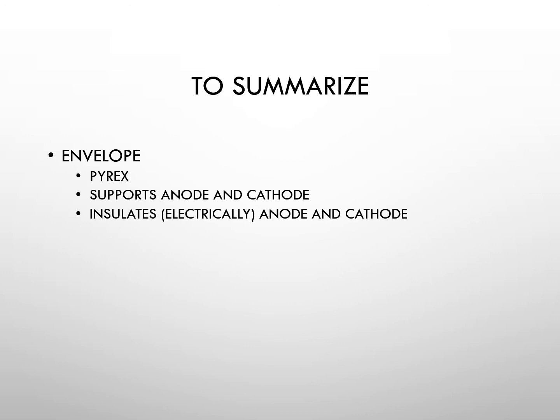Glass has this property. In addition to not conducting electricity, glass will conduct heat. Most materials that act as electrical insulators also do not conduct heat well. Glass is one of the few substances that won't conduct electricity, but will conduct heat. The inside of the X-ray tube must maintain a vacuum. If any oxygen gets inside the tube, the cathode will burn almost instantly.